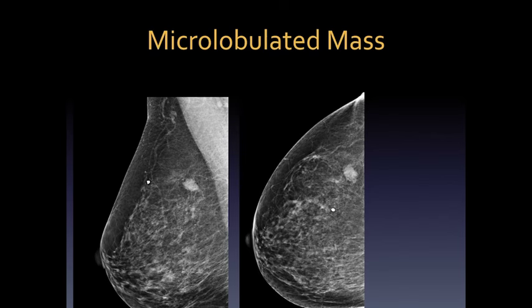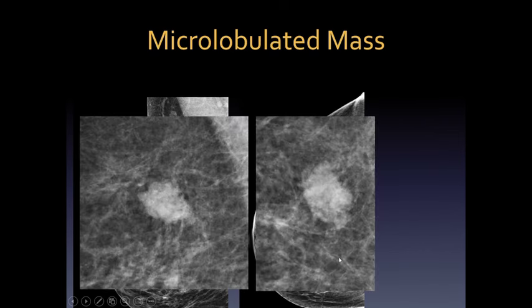Back to the margins — what about microlobulated? This is where we see more than three lobulations. Some people have called this the Ritz cracker appearance. It's a little bit indistinct and should cause concern. This would be a BI-RADS 4B, and this turned out to be a small invasive ductal carcinoma.